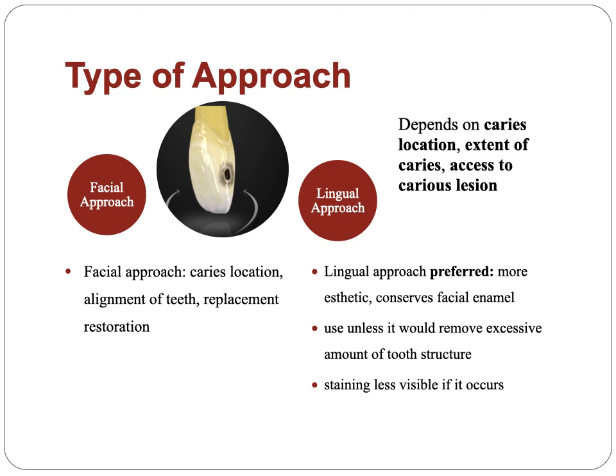If you conserve the facial enamel, then the staining will be less visible if it occurs on your restoration, and we should usually use this approach unless it would remove an excessive amount of tooth structure. In this case, we need to use the facial approach.